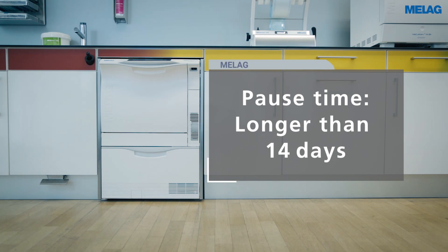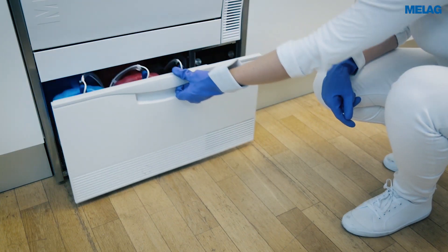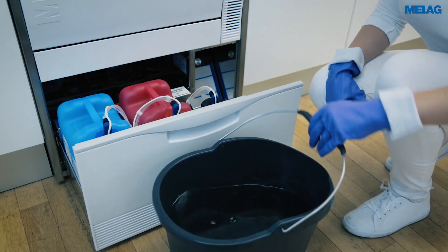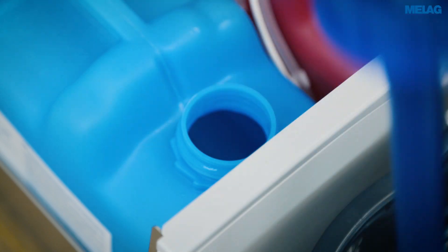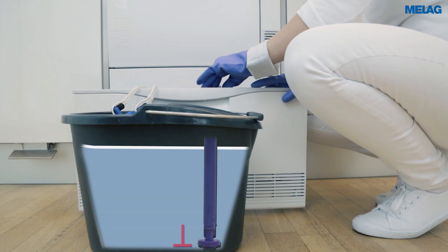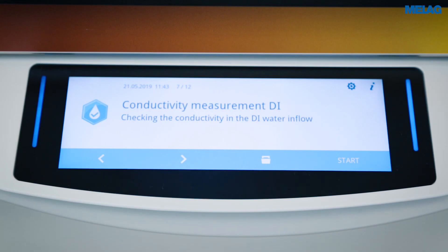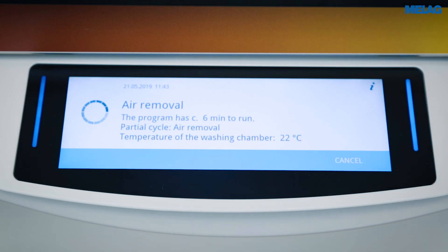If you know beforehand that a long pause time is pending, please perform the following steps. Remove the suction lancers from the process agents and place them in a bucket with water. Make sure that the suction lancers are immersed to a minimum of 80%. Then start the air removal program to free the metering system from process agents.